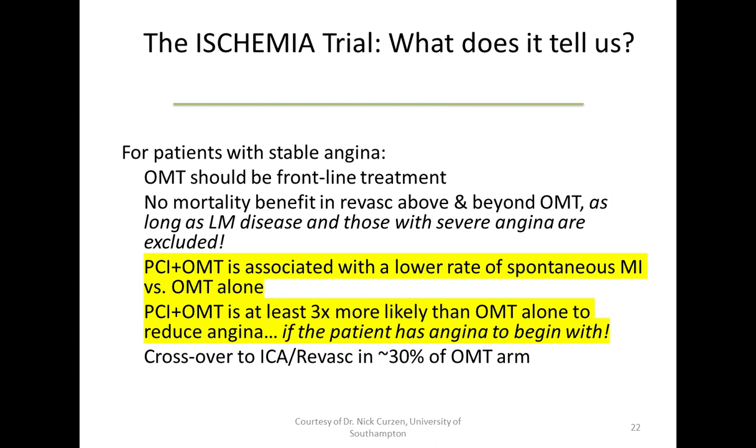And importantly, ISCHEMIA was, of course, a trial that was looking not at the role of CTA nor at the role of invasive physiology, such as FFR, but really trying to help us understand how non-invasive stress testing could guide revascularization. And I think what I've learned from the trial is that it probably doesn't inform revascularization over and above the anatomical disease, and certainly not to the extent that invasive physiology does.